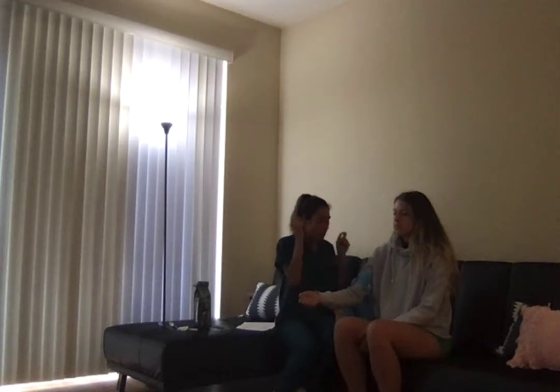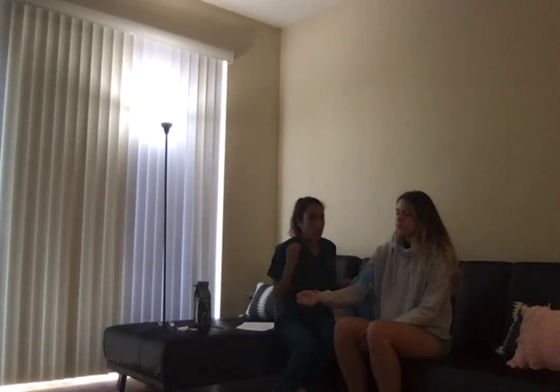So it is 100. So then I will take my stethoscope, I will place it in my ear and put the diaphragm of the stethoscope over my patient's brachial artery, and then I will pump up the blood pressure cuff until it is 20 to 30 millimeters over the 100 that I first noted. So that is the place where the radial pulse had stopped.